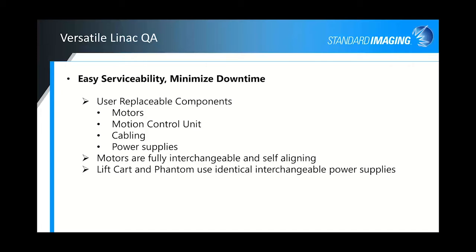We've had a couple instances in the past where someone had set up a diagonal scan incorrectly and irradiated a motor, but that was taken care of very quickly and easily and replaced in the field. So we have added new instruction sets in the manual and alignment crosshairs on the water phantom to help alleviate that as well.